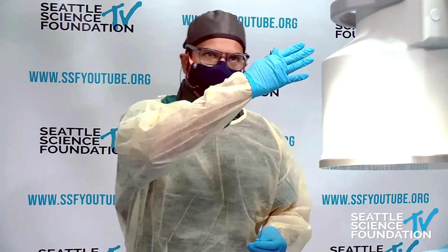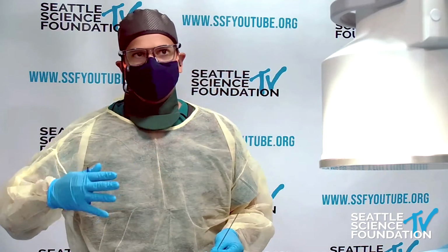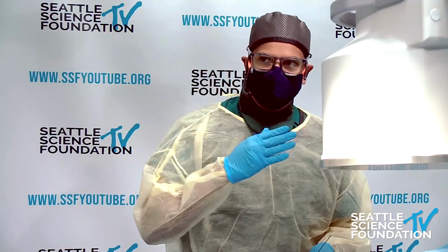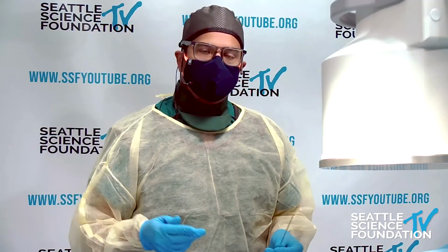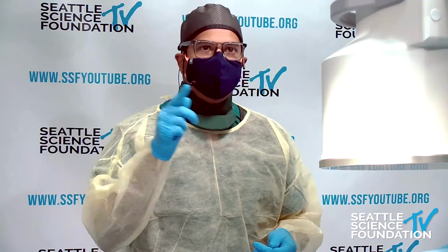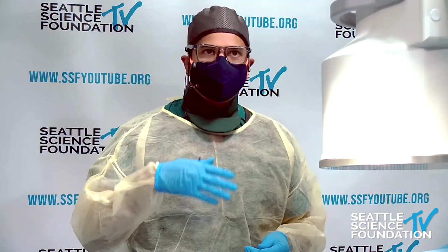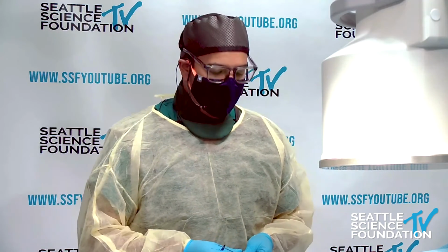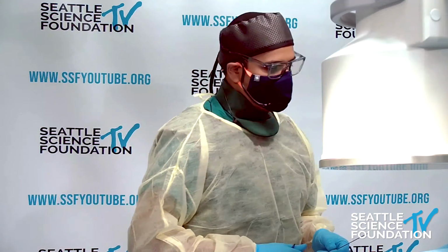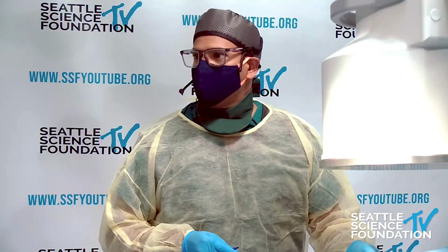That multifidus muscle, as you guys know, stretches from the superior lumbar levels all the way down. It's got unique architecture as it heads down to S1. What we're really trying to do is, whether it's via the nerve, via negative feedback, or via the muscle, via positive feedback, affect the way that individual feels their axial low back pain. So the actual procedure itself is really quite straightforward.